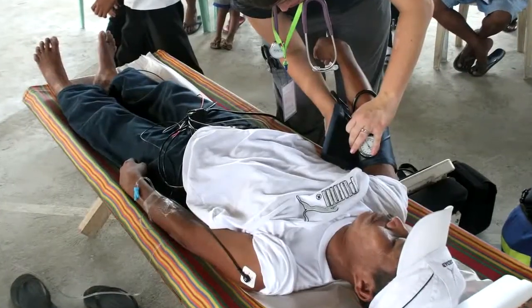The convenience and simplicity of the pocket aneroid have really made it a popular choice among doctors, nurses, medical students, paramedics, even for medical volunteers working anywhere in the world.